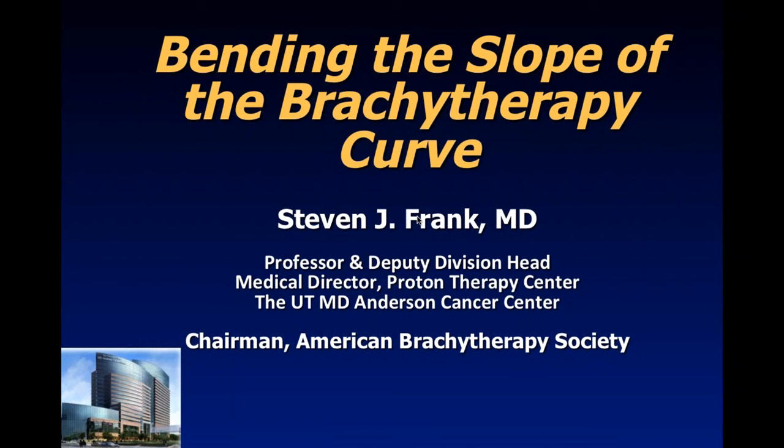That'd be true for LDR, with consideration of starting out with iodine and palladium. I think cesium probably gives a little bit more rectal symptoms just acutely, and we've gone on to publish that and show that from a patient-reported outcome standpoint. But I think all the isotopes can be used and used effectively. But that would be my initial advice to getting up a practice.